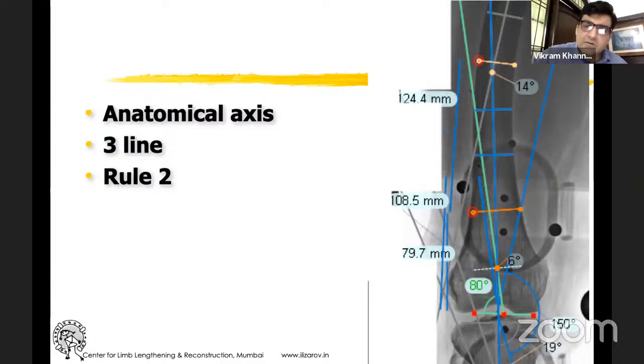You can see that the CORA is down below, just above the notch at 6 degrees, the dotted line. However, since it was not possible to do the nailing, putting the CORA there, doing the osteotomy there, we did it a little proximal to that, and again Osteotomy Rule 2 was applied.